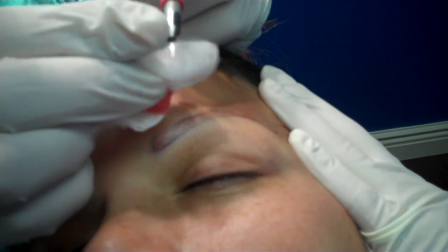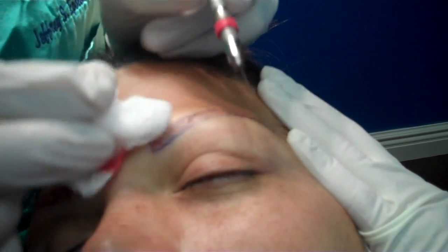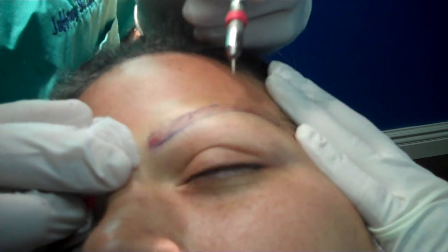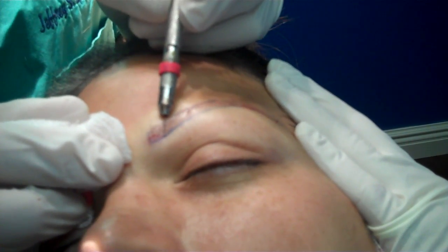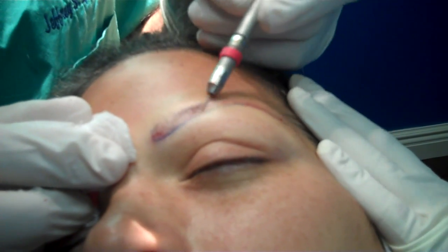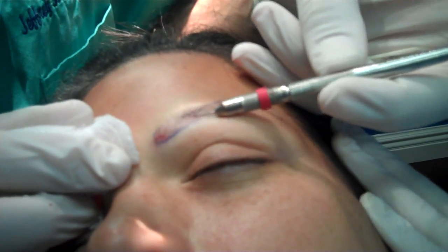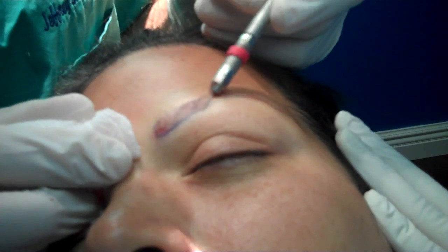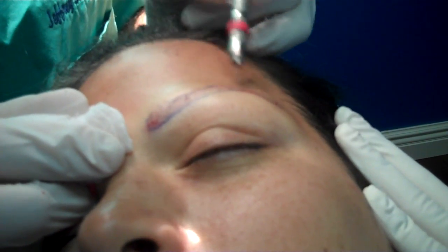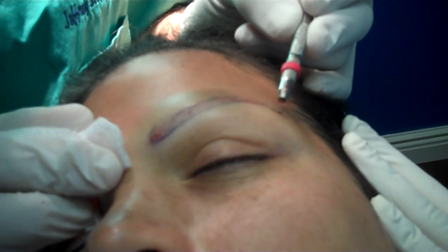This is a 0.5 millimeter blade — you can see how tiny it is. I'll use 0.6 millimeters for the body for two-hair grafts. Basically, the eyebrows divide into three portions: the head, where hairs mostly grow in a vertical direction; then very quickly they grow in a crosshatch pattern, with upper hairs growing downwards and bottom hairs growing upwards in the body; and then lastly in the tail.